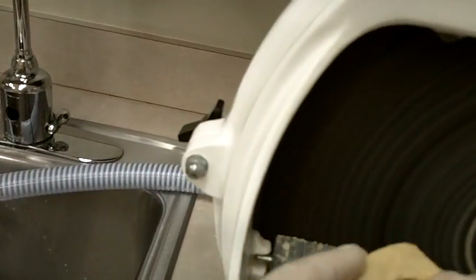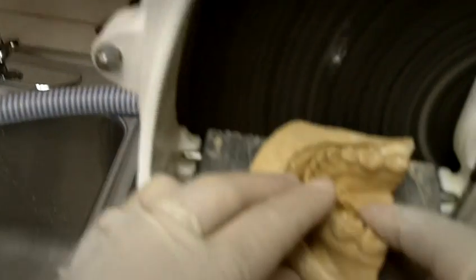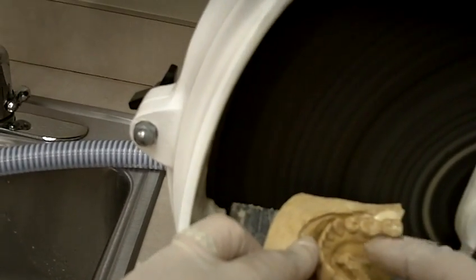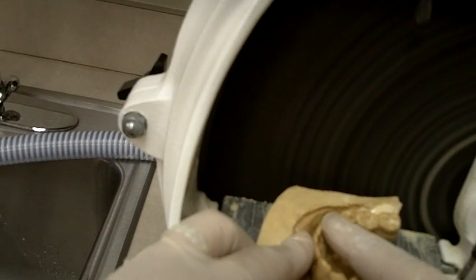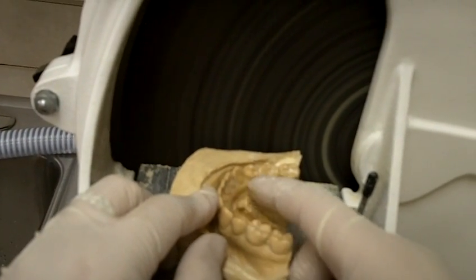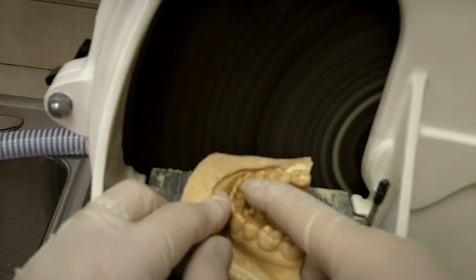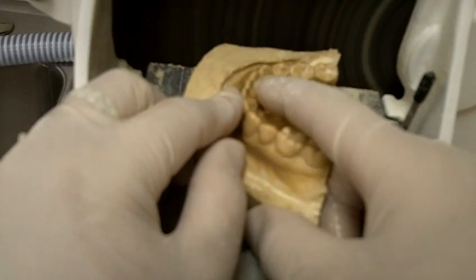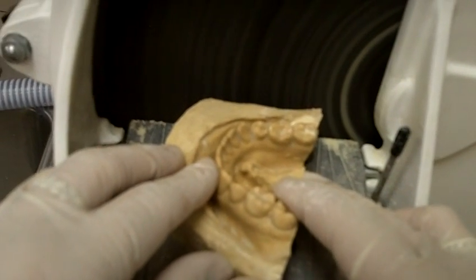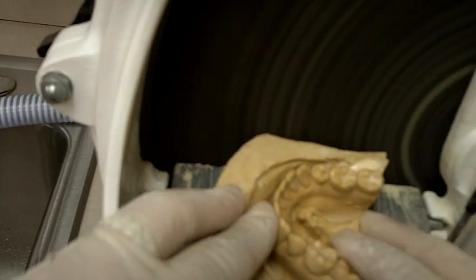So we're going to do the same thing. We already worked on the back part here, on this part. Now we're going to do the sides. And then we know for here it's going to be premolar. Now this one only has one premolar, so we're probably going to go right between, so it goes premolar to canine. So you're just going to have to think of where it would normally be. If there were an extra premolar, we would use that one. But since we only have one premolar and a canine, we're going to go ahead and use the canine because one premolar is missing, okay? Again, it's going to be flared out.